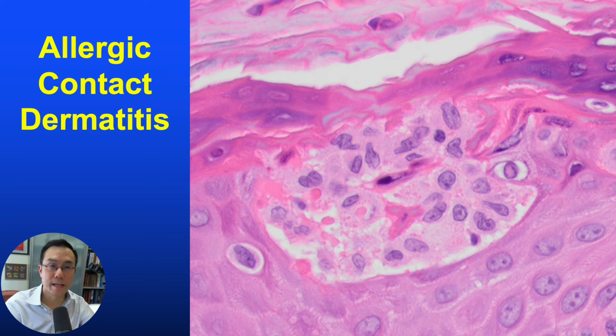So for now, as has been recognized by experts in the field for decades, and now more rigorously confirmed using quantitative methods and robust clinical correlation, the Langerhans cell collection appears to be the single most distinctive histopathologic feature in allergic contact dermatitis.